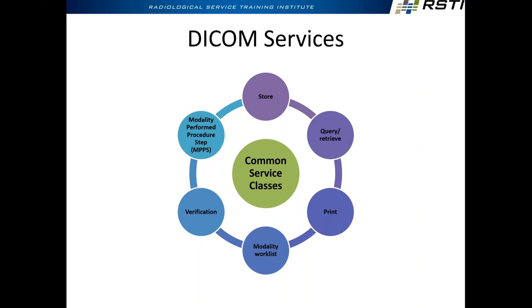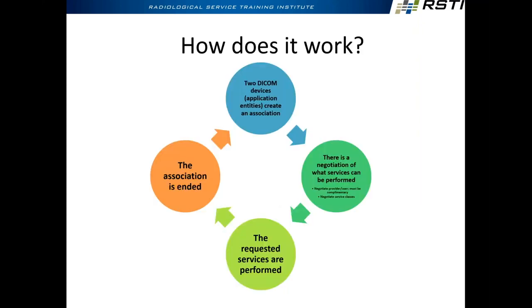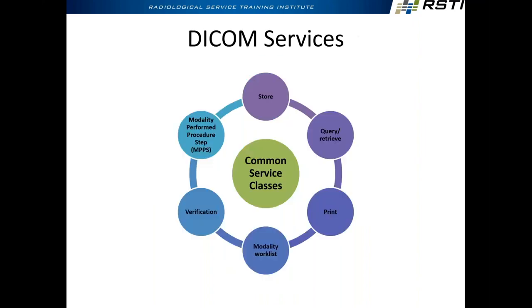DICOM echo is what does the handshake. You could have ping succeed, but none of this works. Now we have solved the problem. So what ping and echo allow us to do is differentiate hardware versus software and content issues, that kind of thing.